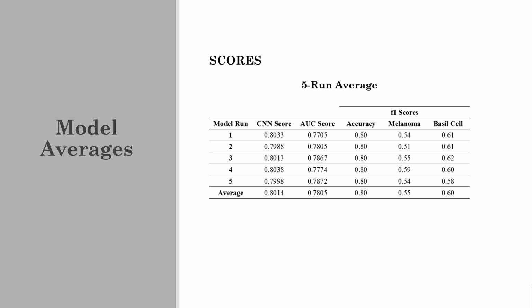Many runs with different augmentation values either showed no improvement or caused the model to behave badly. Increasing the class weights for minority classes, such as for melanoma, did not work at all.